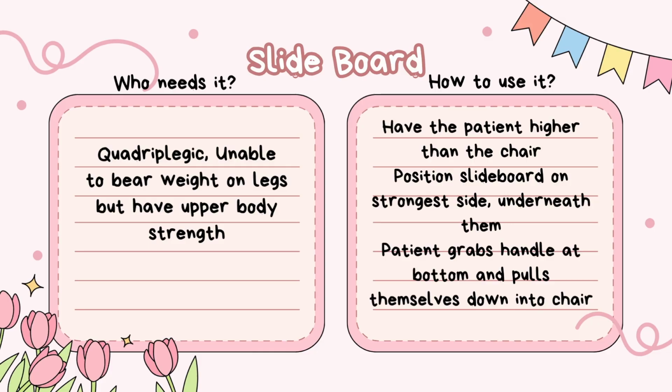Sometimes we may use a slide board for our patient. Slide boards are typically used with quadriplegic patients or patients who are unable to bear weight on their legs, but they have good upper body strength.